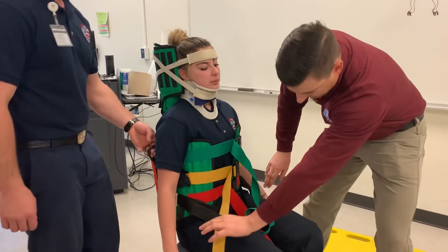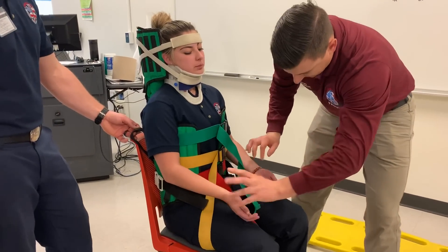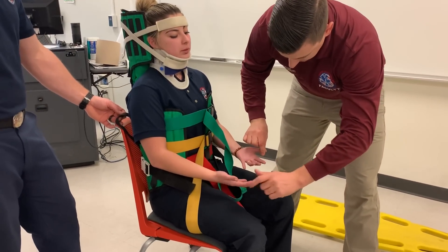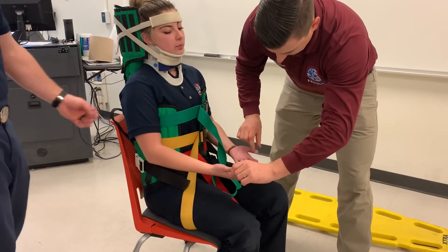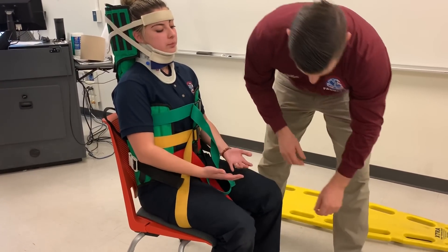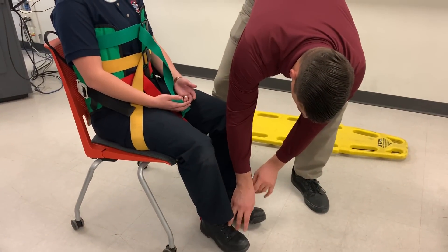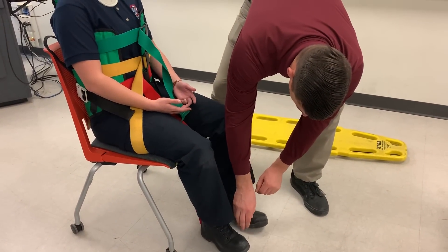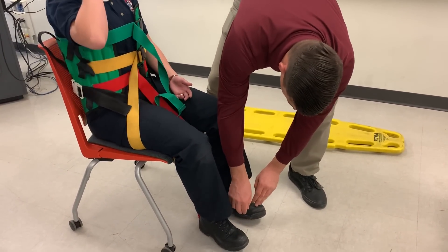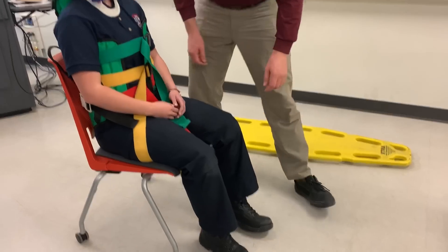We're going to assess PMSCs again. Pulse. Wiggle your fingers for me. What finger am I touching? Thumb. What finger am I touching? Thumb. And capillary refill. Repeat the same on the feet for pulse, wiggle your toes, what toe am I touching, and cap refill.